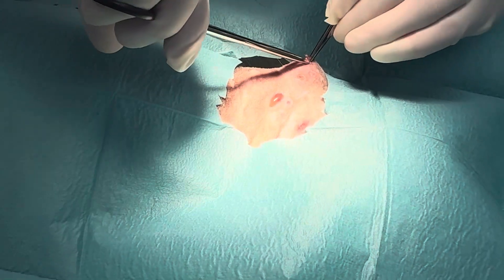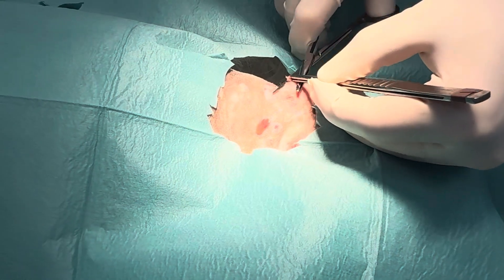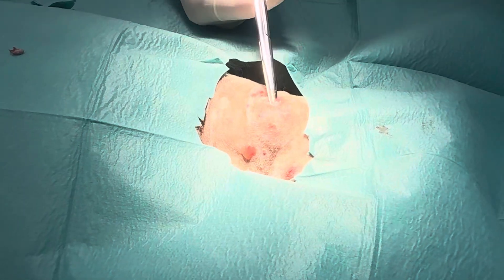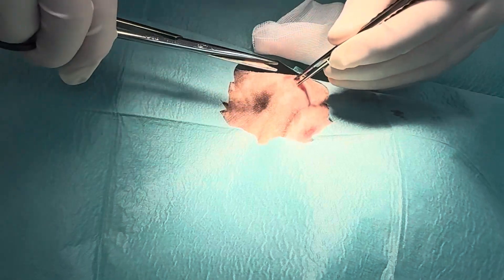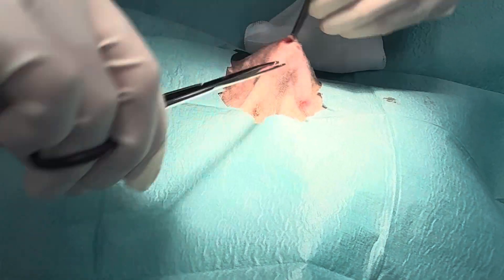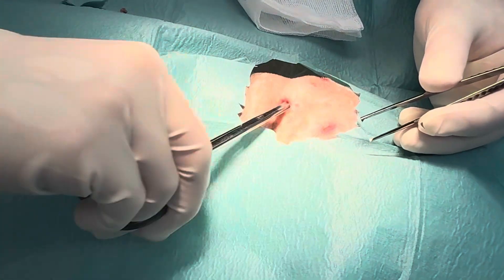You want to debride some of this tissue. Don't go crazy. You can see there's a big pocket in there. This is a dirty surgery — I'll try and keep sterility but it's going to be a very dirty infection inside. You can see all the pus coming out as they open up. The reason for debriding is because sometimes the tissue dies on the outside and it's going to increase the healing effects, and you can see this goes all the way through.